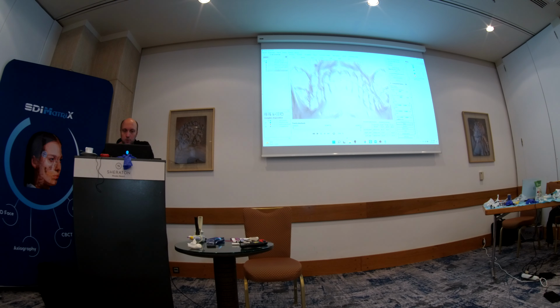The incisal point of the upper jaw is placed on the incisal edge of the upper incisor, on the medial corner, either tooth 1-1 or 2-1, it doesn't matter. Then the lower incisal point. Sometimes it's hard to place it because there is overbite and we don't see the incisal edge of the lower incisors.